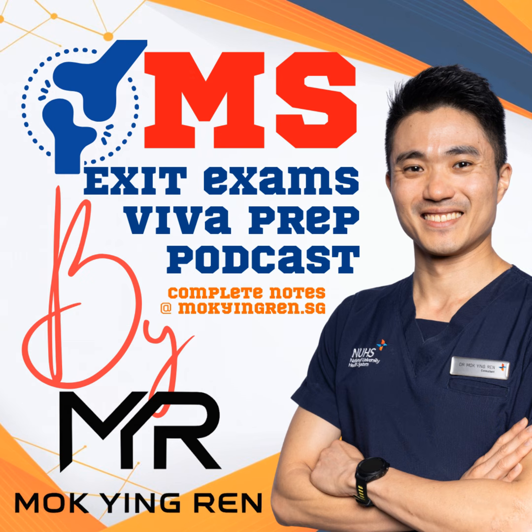What about for a unicondylar knee arthroplasty, a UKA or partial knee? Same applies. For UKA, the discussion is a bit different, often focused on fixed versus mobile bearing within the UKA implant itself. The general stance, often influenced by specific implant systems like the Oxford mobile bearing or fixed designs like the Zimmer ZUK, leans towards fixed bearing for many surgeons.